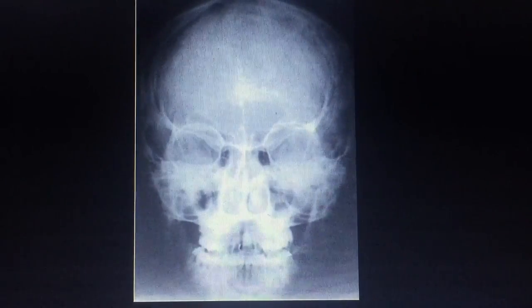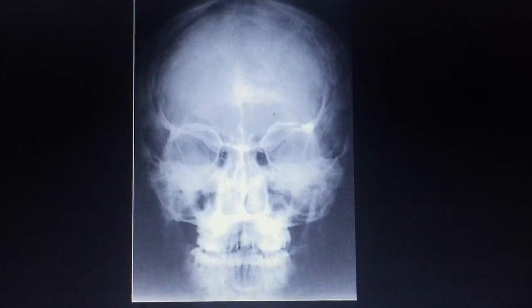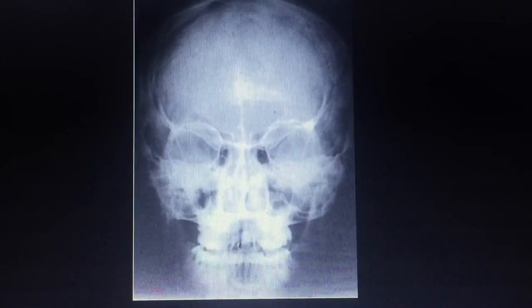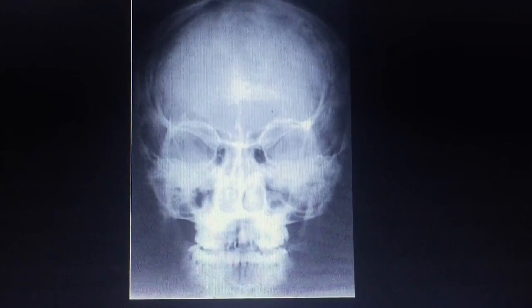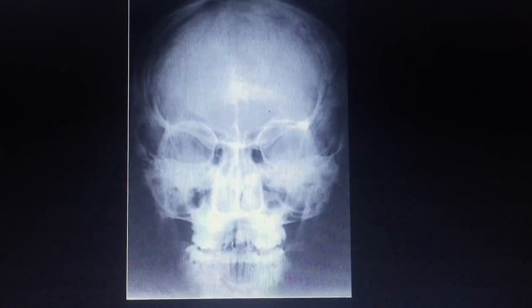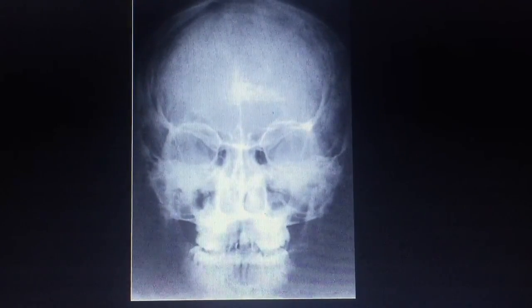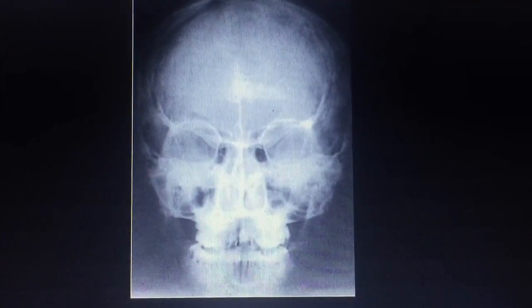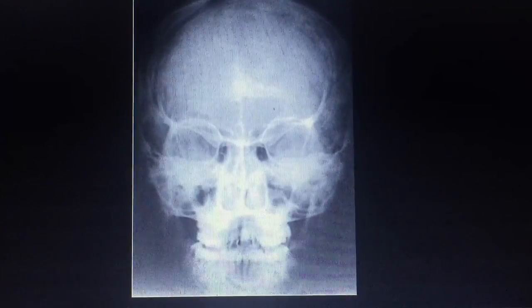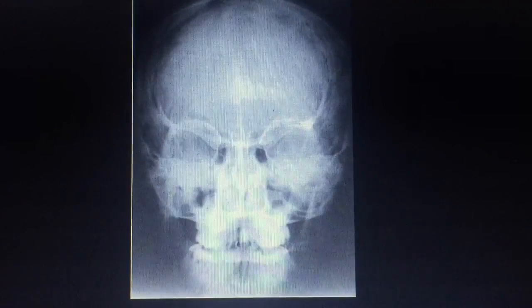The next image that I'll evaluate is my PA axial skull Caldwell method. And when evaluating this image, I'm looking for proper collimation. I want to make sure that the entire cranial perimeter is showing three distinct tables of the squamous bone. Also, that there's equal distance from the lateral border of the skull to the lateral border of the orbit on both sides. You want to make sure that there are symmetric petrous regions.